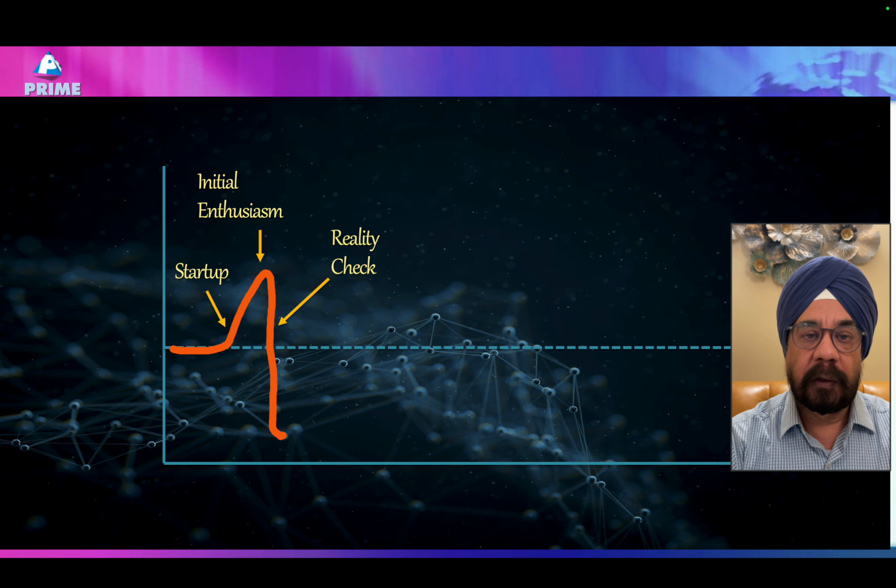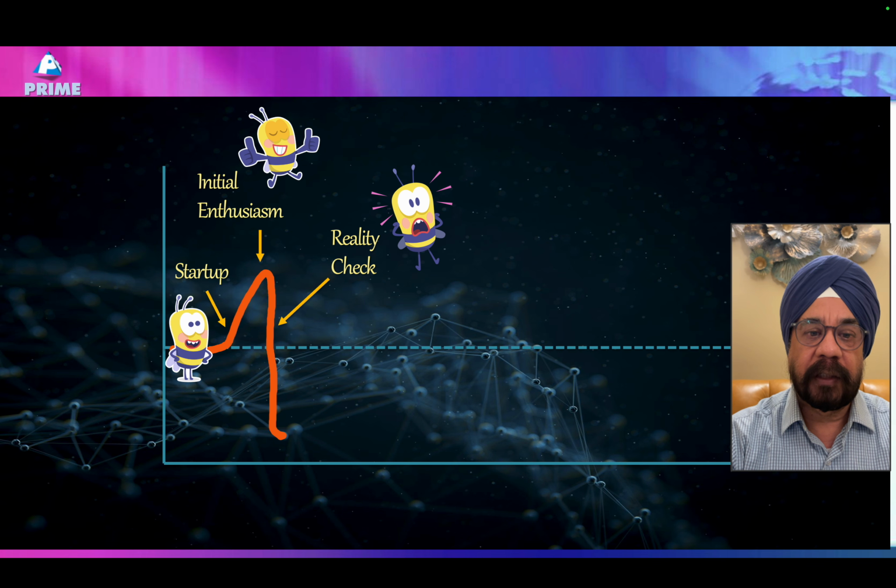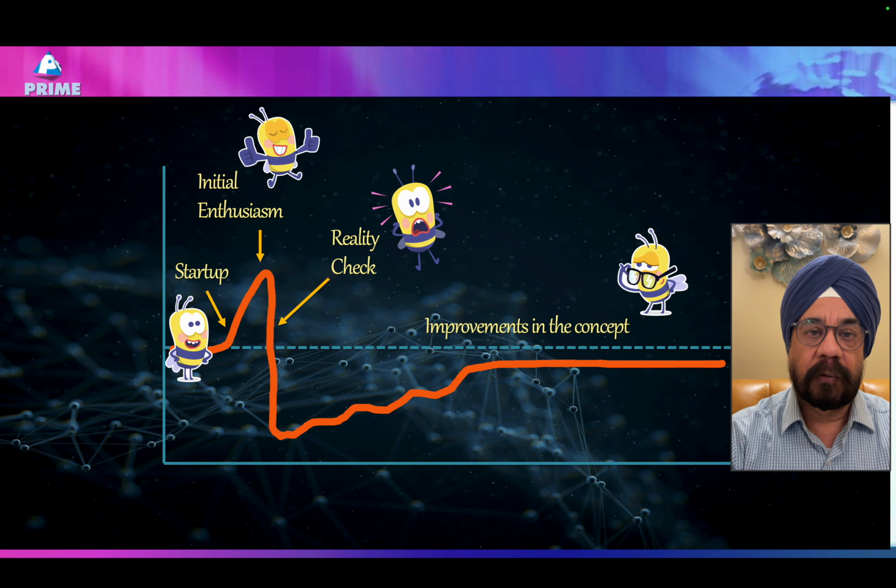Whenever there is some new technology, we are so enthusiastic and happy about it, and then we do a reality check, we do comparative studies, and we are sobered by those studies. Then we realize we need to improve on technique before we reach realistic figures. So now the reality is different.